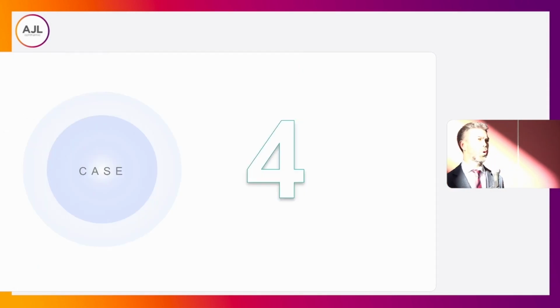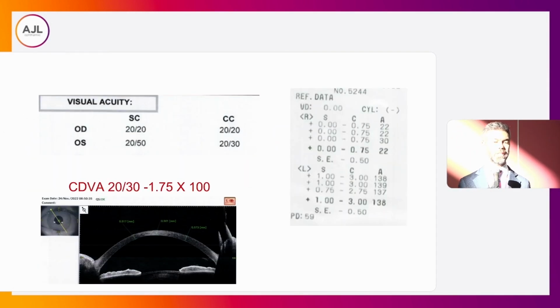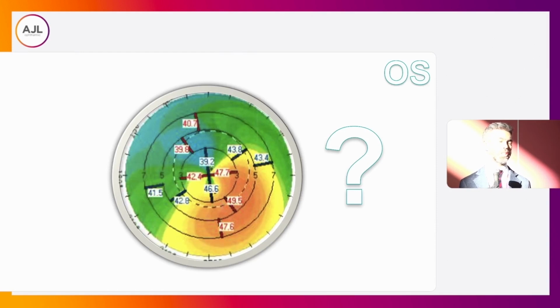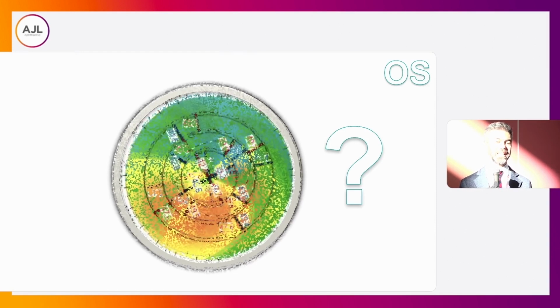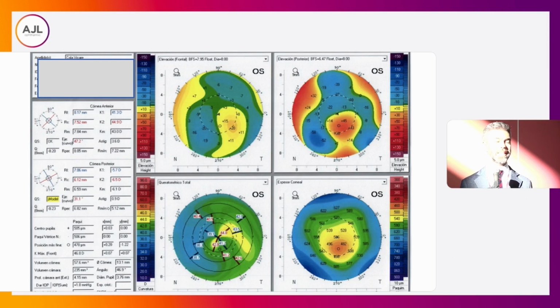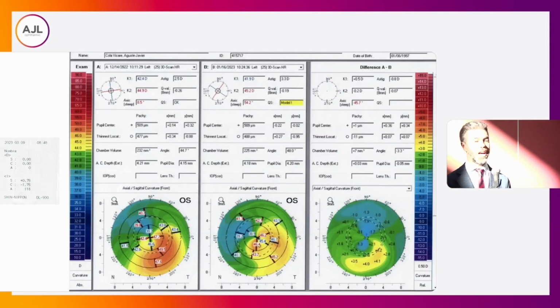So sometimes you have different parameters or different phenotypes. This was like a duck, but the direction of the duck is horizontal, so it's different. I had to think about this case like a right eye, but it was a left. So the incision was different. I performed it in that way, and you can see there the difference between one surgical plan and after the surgery.